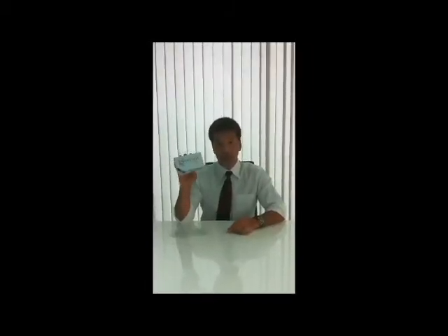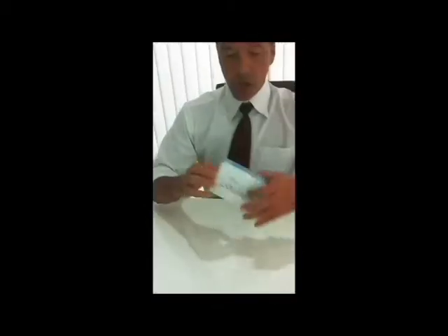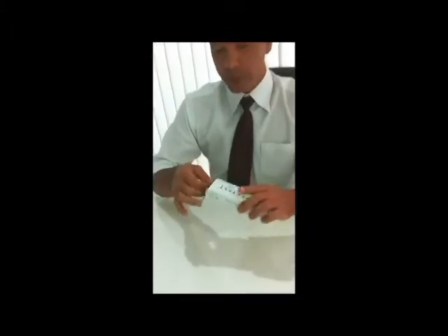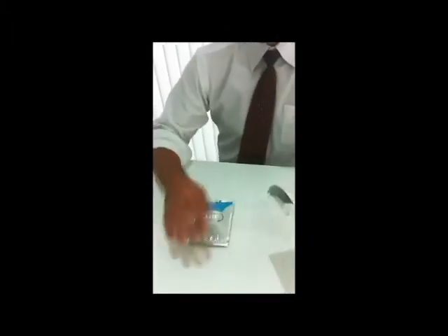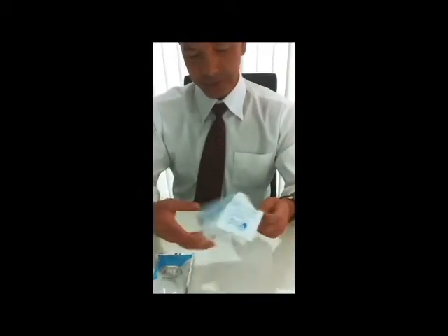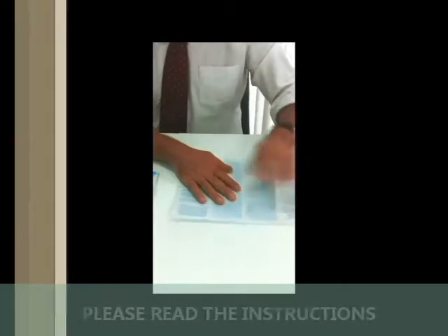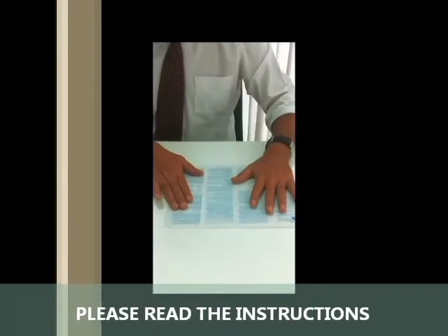Today I'm going to show you how to use the SureTest Medical HIV Rapid Test Kit. Opening the box, you'll find inside one package and your instruction inserts, which you must read thoroughly before you commence doing the test.